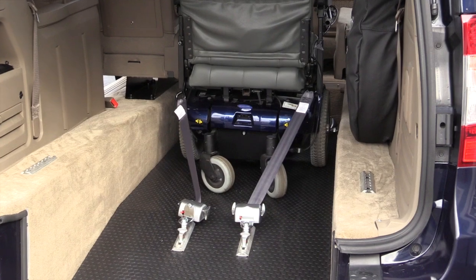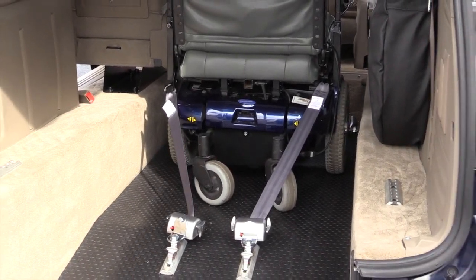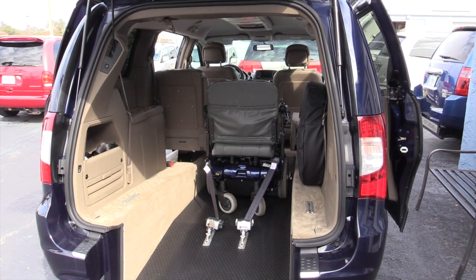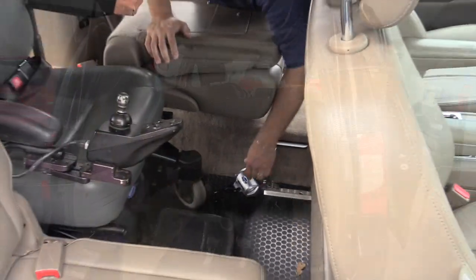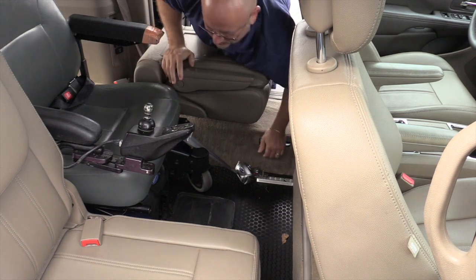Now your wheelchair is secured in the rear with two retractable tie downs, so you can move to the front to secure the two in the front. The front retractors are easily connected to the wheelchair.